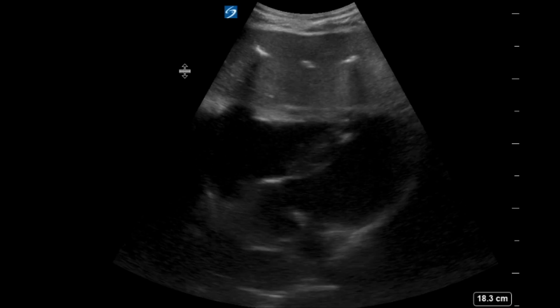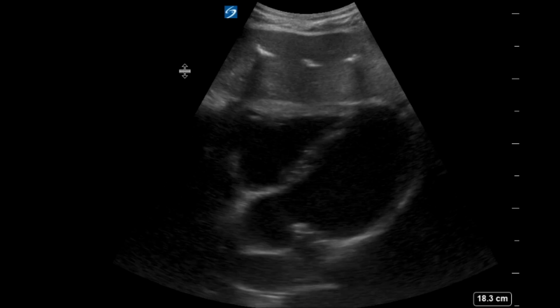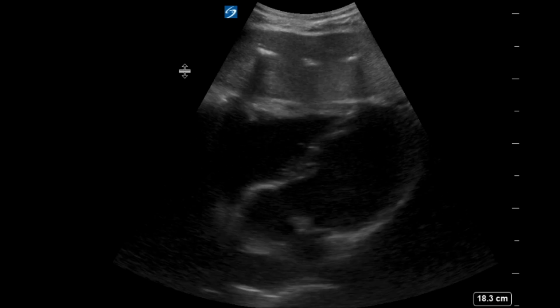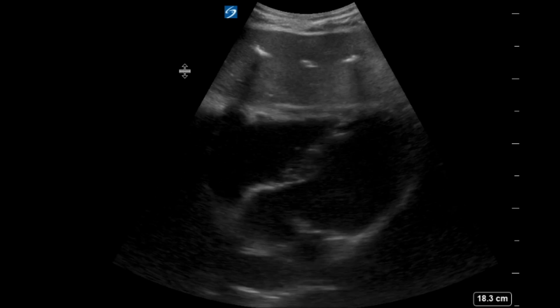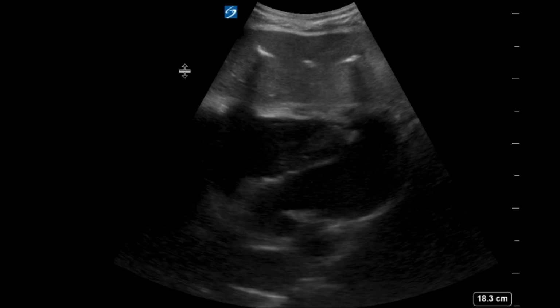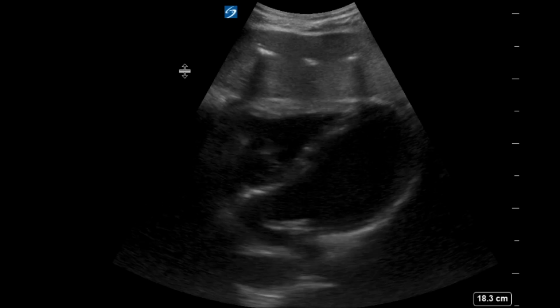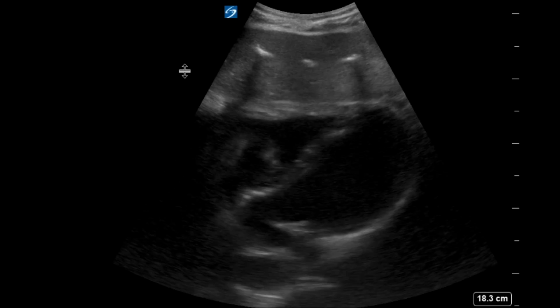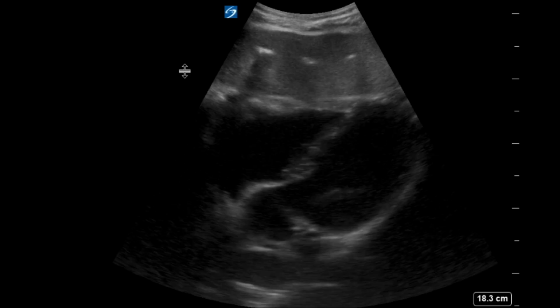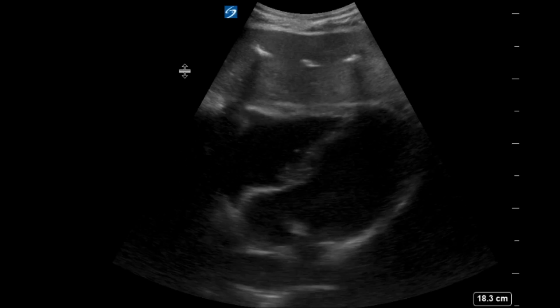Yeah, exactly. So with the hepaticojejunostomy, there's some surgical connection made between the biliary tree and the jejunum, because there's some sort of obstruction elsewhere within the biliary system, so it needs to drain that way. So that air, which is normal bowel gas within the jejunum, can reflux retrograde up into the biliary tree. So that's sort of an expected post-operative finding in someone with a surgical history. You'd be more concerned if this is a new finding, or it's more diffuse, or the patient presents with concerning findings like fever, right upper quadrant pain, and sepsis-type vital signs.